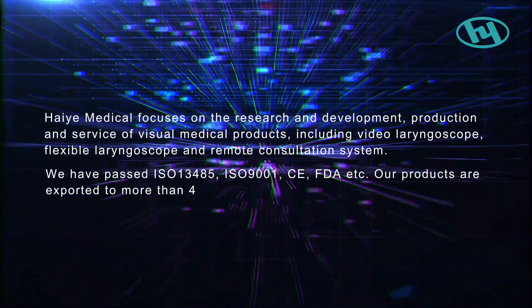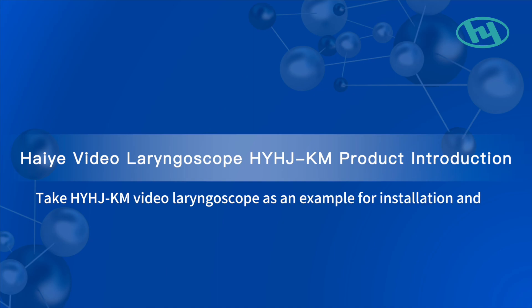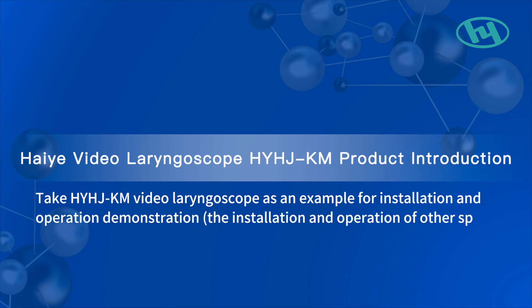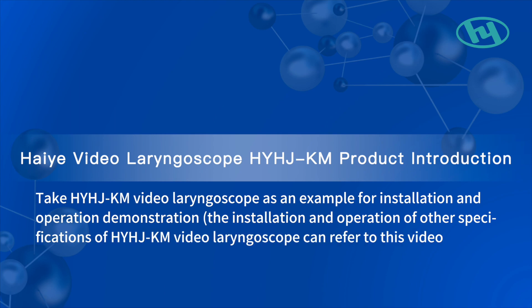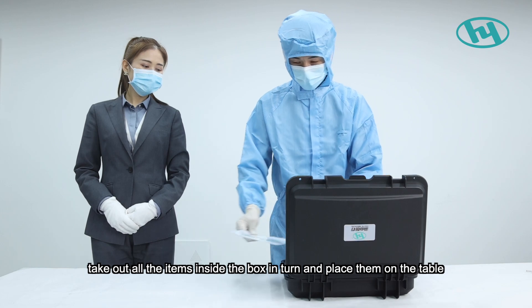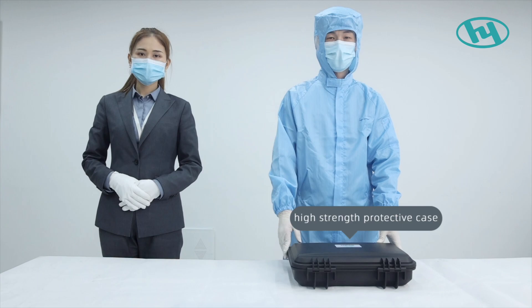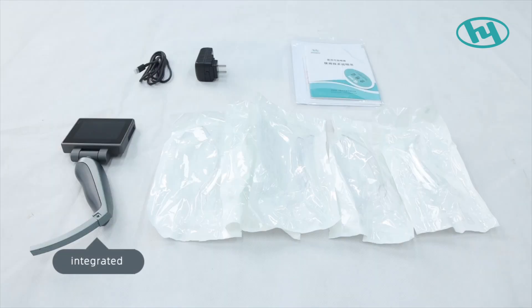Our products are exported to more than 40 countries. Taking the HYHJ-KM video laryngoscope as an example for installation and operation demonstration. Open the protective box and take out all items inside. Component names: one, high-strength protective case; two, integrated main unit; three, special charger; four, special data line.